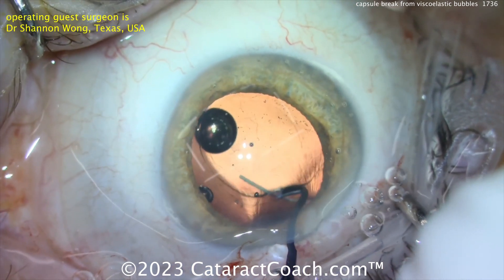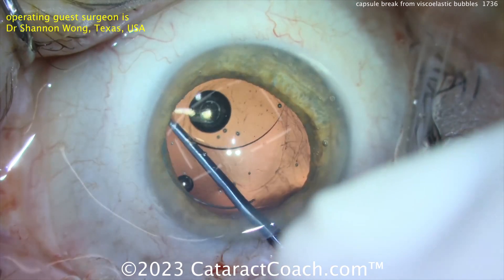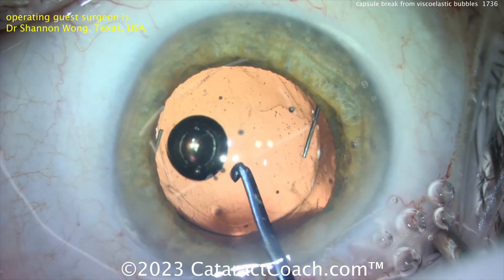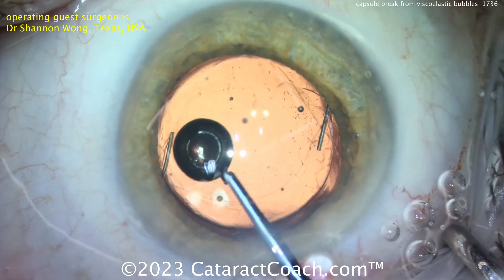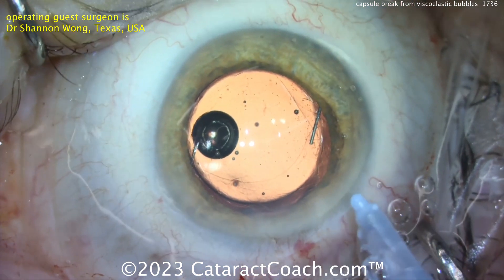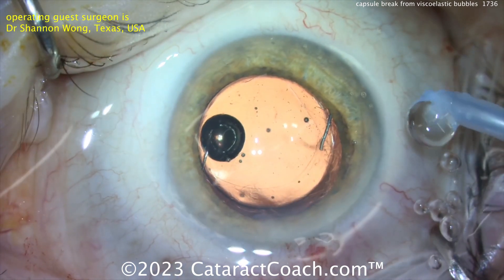...the haptics from the sulcus, plus this lens has a slight angulation rather than being totally planar, means you don't really need to adjust the IOL power. The eye power can remain the same as for an in-the-bag placement, because that optic is literally behind the rhexis — technically in the bag or what's left of it. The result is a beautifully centered lens that will be stable for the patient's lifetime.